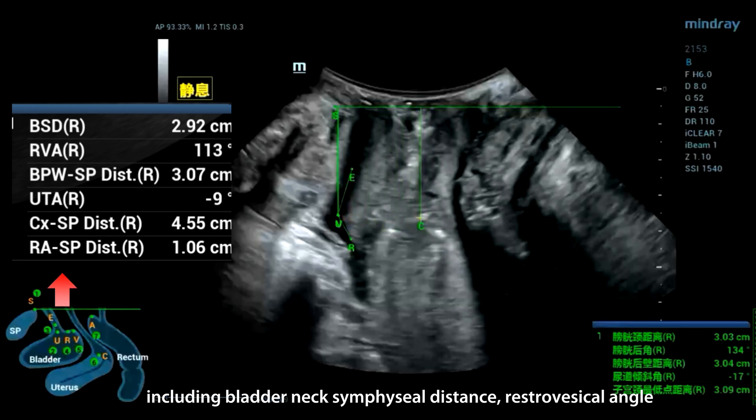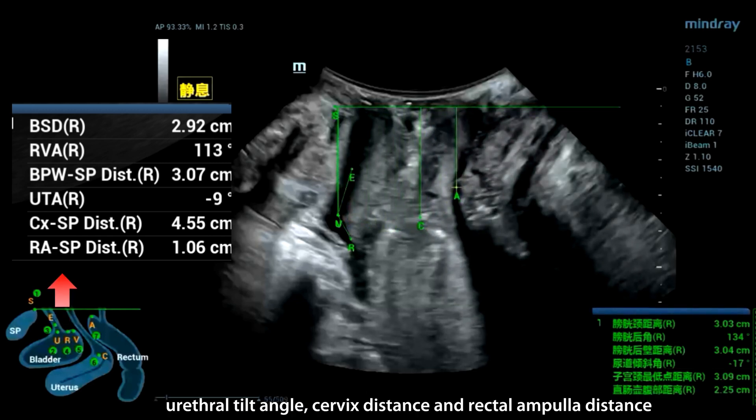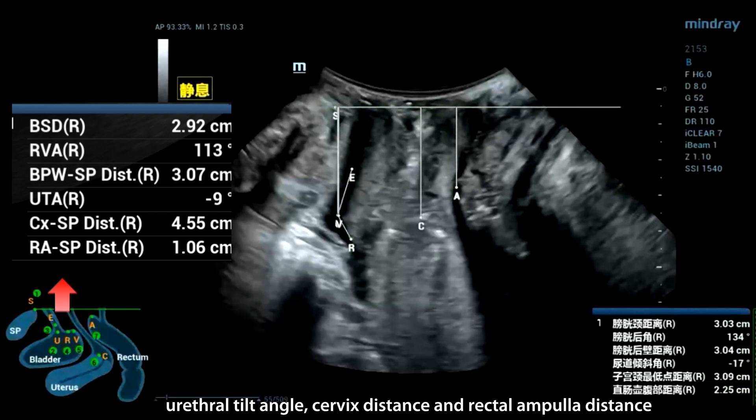Parameters obtained include bladder neck symphysial distance, retrovesical angle, urethral tilt angle, cervix distance, and rectal ampulla distance.